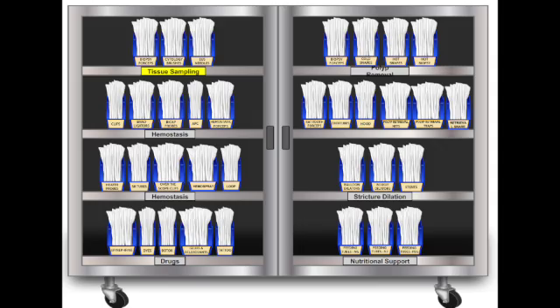And finally, hot biopsy forceps. Uses electrocautery. Good for slightly larger or flatter polyps that might bleed a bit when you just pull them off. The heat helps cauterize as you remove it. Okay, so we've surveyed, we've sampled. Now let's move into fixing things.